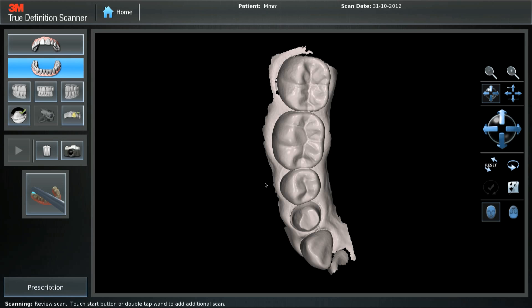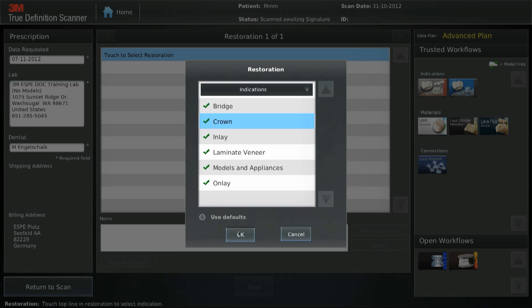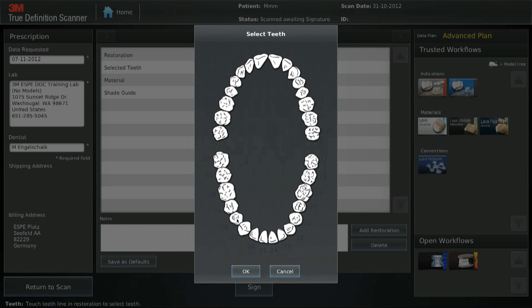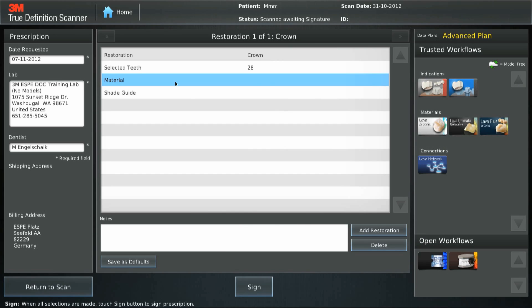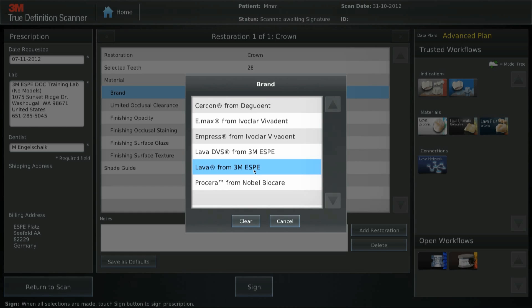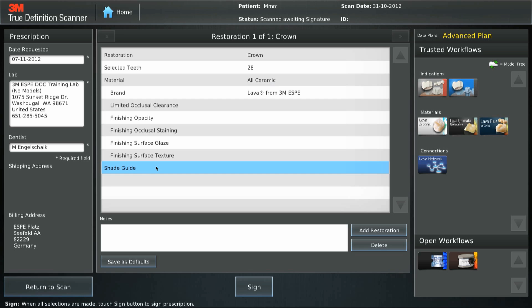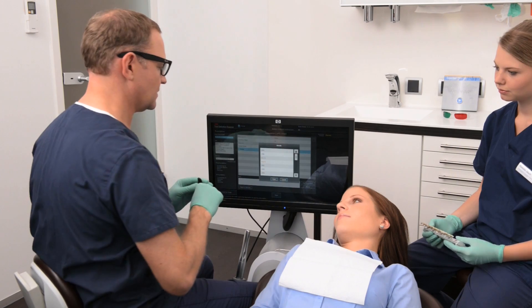To complete the lab prescription, select the prescription icon in the lower left corner. Touch to select restoration type — for example, crown. Choose the tooth number, or tooth numbers if there is more than one restoration of the same material. From this point, all other information is optional. Do not forget to enter the tooth shade information, as this is also optional.